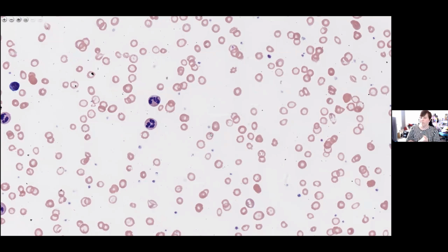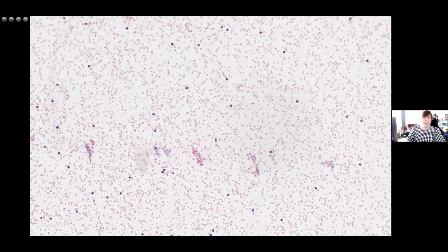I've got one question, Nicole. Sure. Patients who are this anemic, where do you look to see whether there is true rouleau or not? And how do you exclude it? Because we've got this field here. There are a whole load of cells which are stacked on top of each other. Sure. I always find it very difficult. It is. And as you have a virtual slide here, it's a little bit less easy to show. Essentially, what I would do is on the physical slide, I would look where I normally would cast my eyes for a monolayer, which is about 2/3 of the way down the actual physical smear. And I would check there to see what the actual field looks like.